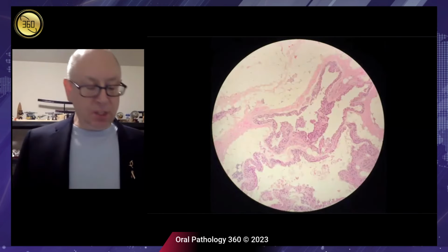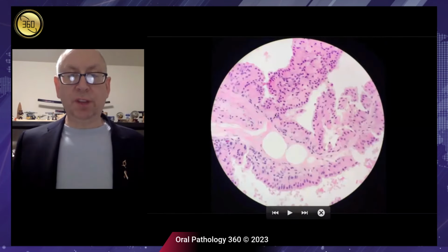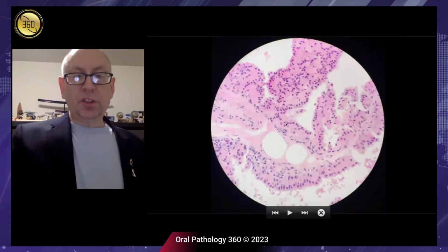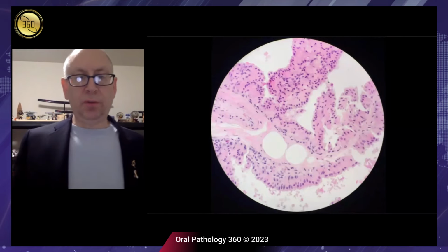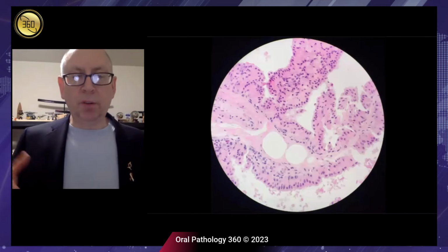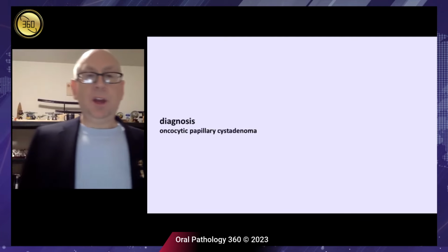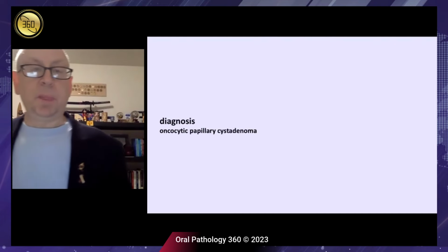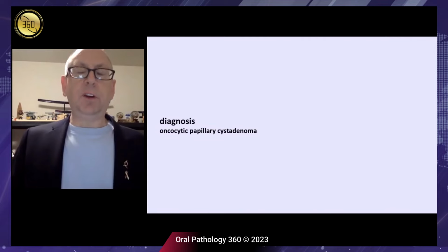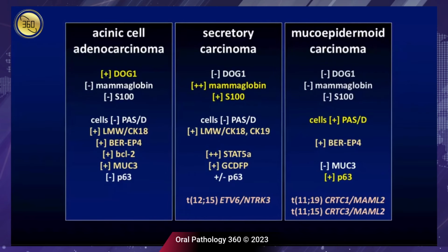They seem to be respecting each other's borders. Even though there's a lot of infolding and papillary features, the nuclear features are still fairly innocuous. They're somewhat hyperchromatic, but they're all very small and fairly round and don't seem to be overlapping. And I would ask my learners at this point to tease it out. And this one turned out to be a benign tumor. But you have these cystic tumors that are either benign or malignant, and you only know that by looking at the cells. So the question is how can we tease these three or four lesions out?